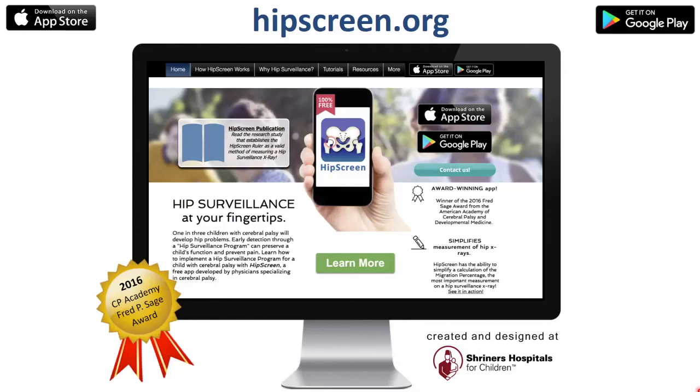So I hope that you found this presentation useful. I hope that you'll share it with your colleagues. We think that the HipScreen app could be used by parents as well to better understand the process of hip surveillance. And we think it allows everyone to engage in this important process of hip surveillance that has been shown to be so helpful and so impactful for children with cerebral palsy.